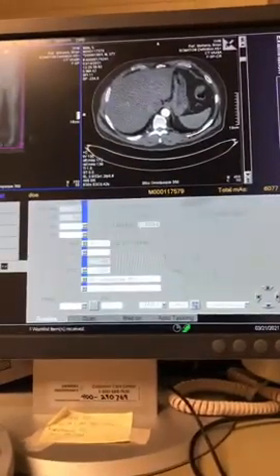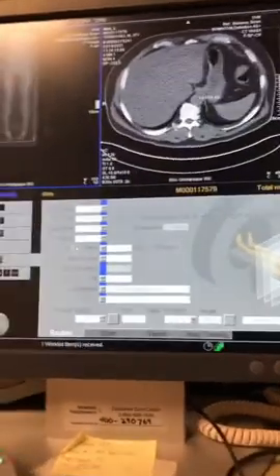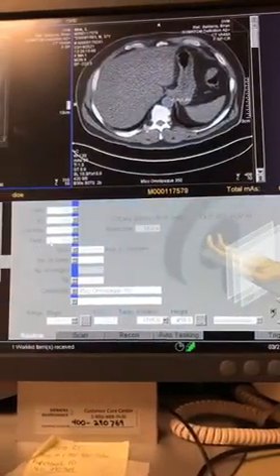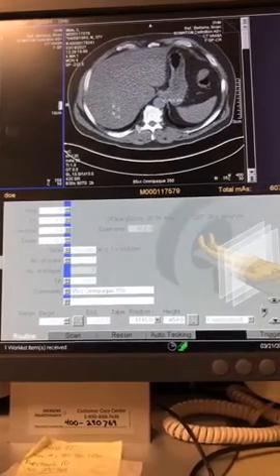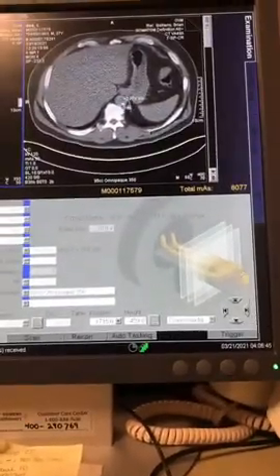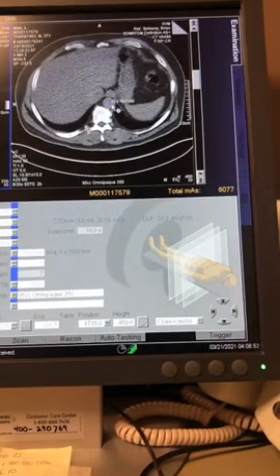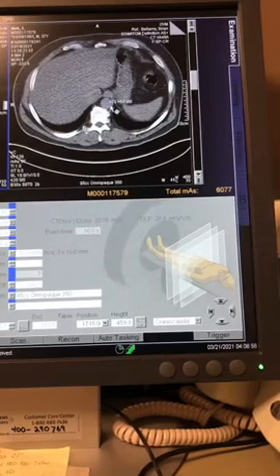If we look here, we bolus track and it counts down 10 seconds before it starts. You guys can see that there, right? On the monitoring one here, we've got a 10-second countdown. So we start our contrast and our scan at the same time. It counts down 10 seconds and takes a picture. The first picture there is measuring 0 Hounsfield units, so like blood or water in the descending aorta. As we continue, the next picture is 21. The next one's 10. That is a good thing to note. Do you see that? We go from 21 down to 10 again.